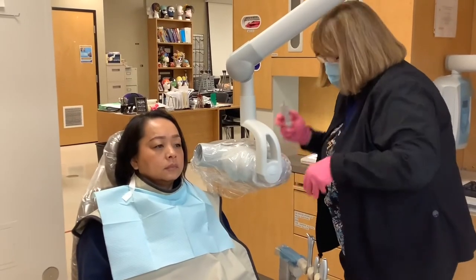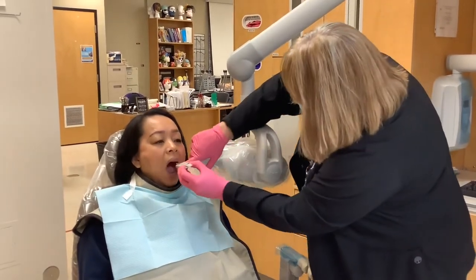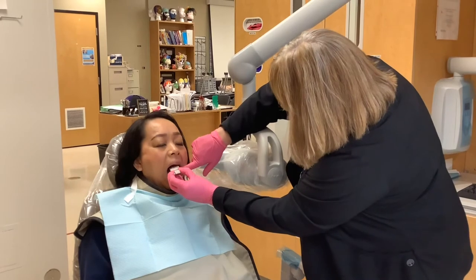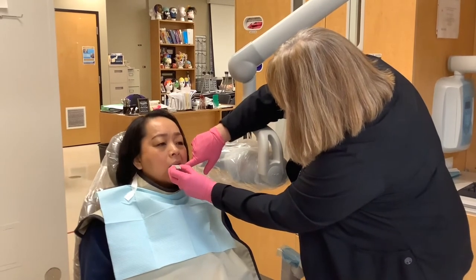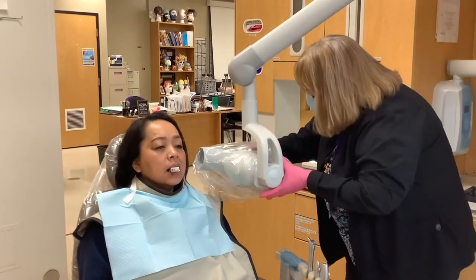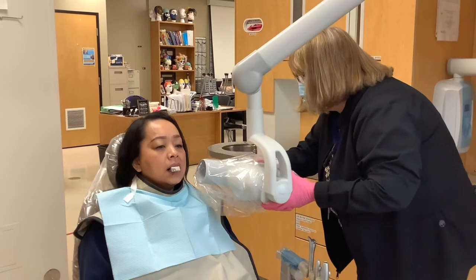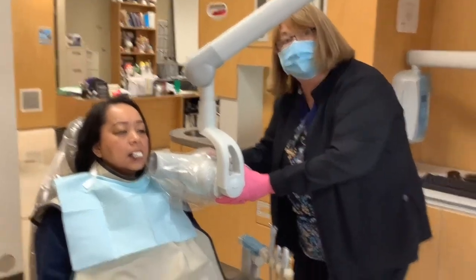Next shot is my bicuspids — new film. Now I'm going at negative 10. Bite down. Now I'm going at negative 20.